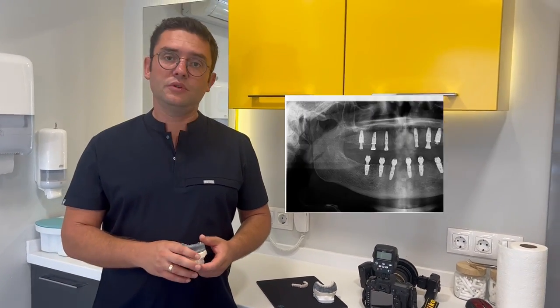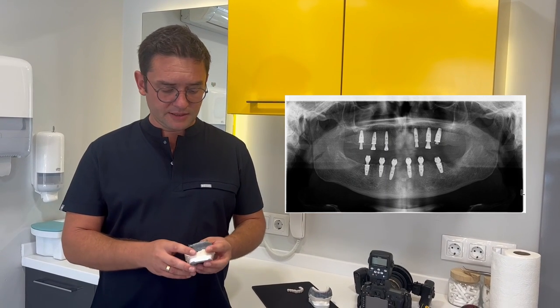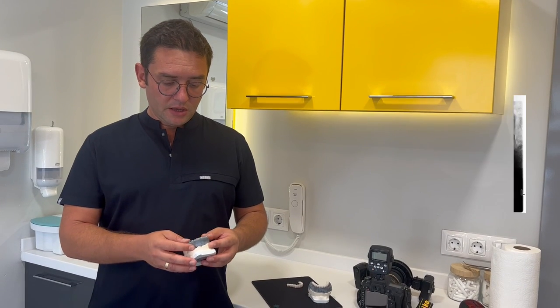We removed her old top and bottom teeth and placed 6 implants for the top and 6 implants for the bottom. Then we made dentures as a temporary solution.